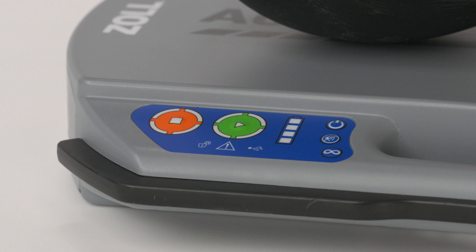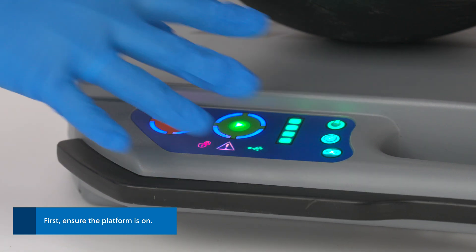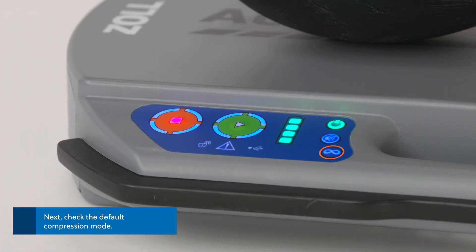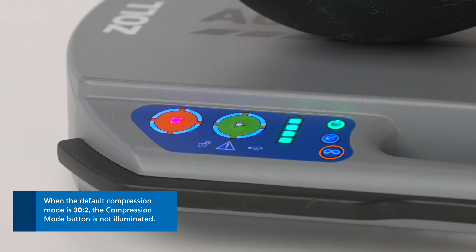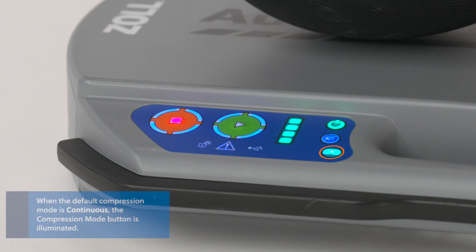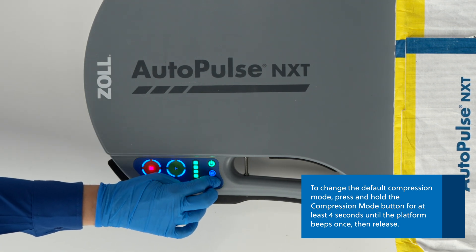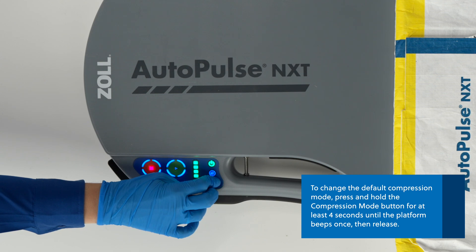Configure the default compression mode when you are setting up the platform. First, ensure the platform is on. Next, check the default compression mode. When the default compression mode is 30 to 2, the compression mode button is not illuminated. When the default compression mode is continuous, the compression mode button is illuminated. To change the default compression mode, press and hold the compression mode button for at least 4 seconds until the platform beeps once, then release.